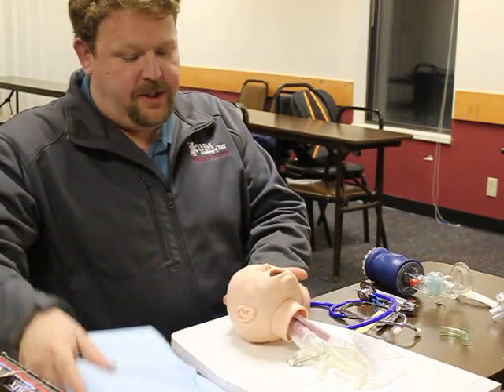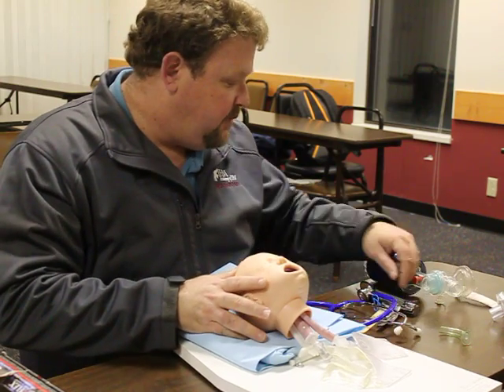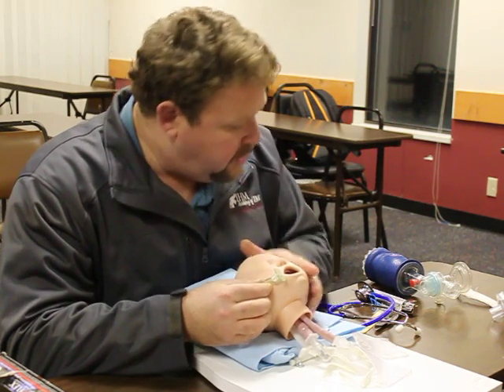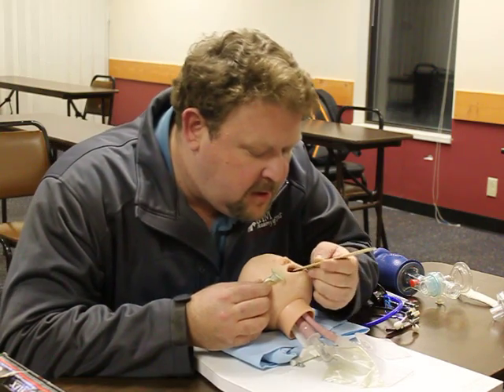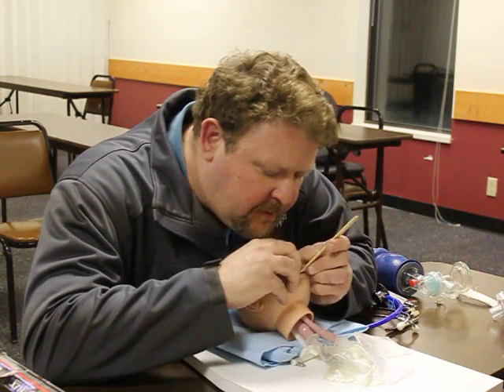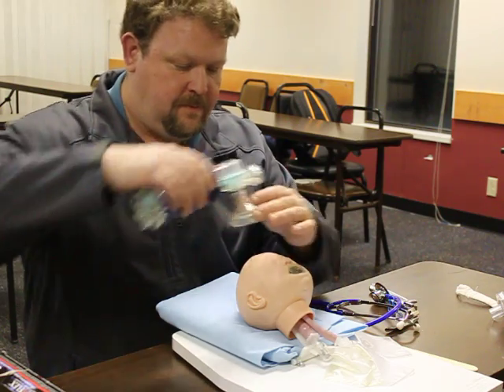I'm going to position the pad underneath the shoulder blades so my patient is in the proper position. I'm going to go ahead and select my oropharyngeal airway — go across the corner of the mouth to the earlobe. I'm going to utilize my tongue depressor since this is such a small child, and go with the natural curve for the OPA. No gag reflexes present and patient accepts the adjunct.